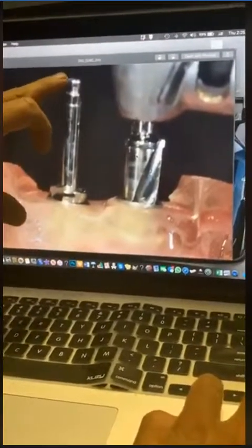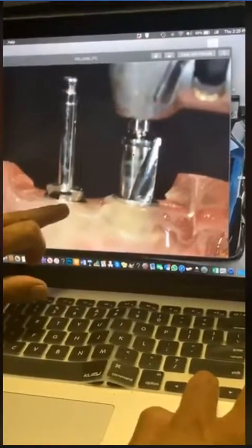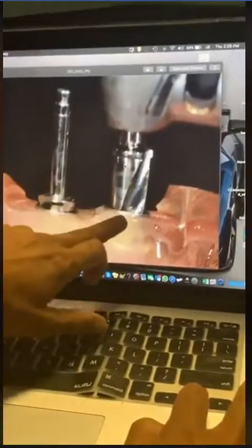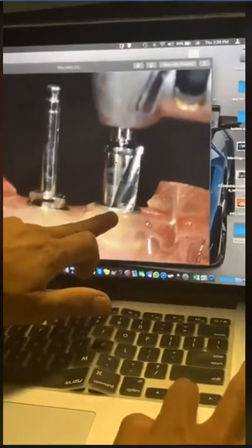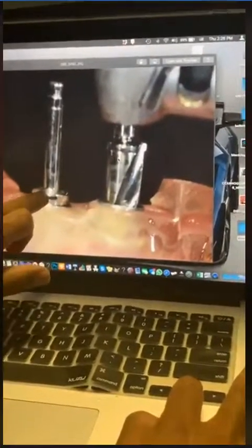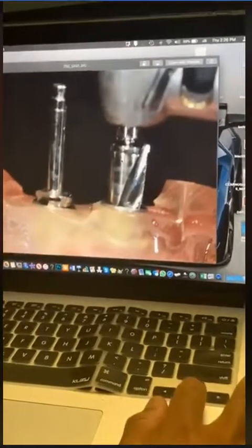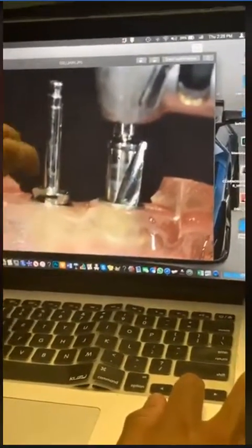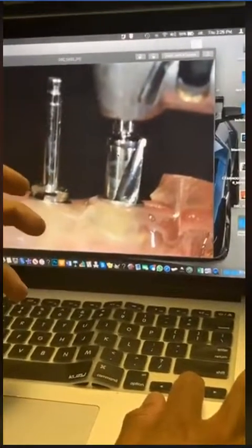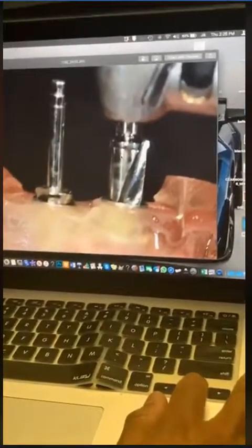And one thing I do is, once I make an osteotomy, this was 13 millimeter long, and I'm making the other osteotomy, and this is a 13 millimeter long burr, but I don't have 2, of course. So I put another, the 11.5 in here, and it gives me a little bit more support. Okay, so now this is in there just for me to make sure that the guide in the anterior is also stable and it's nice and strong while I make the second osteotomy.